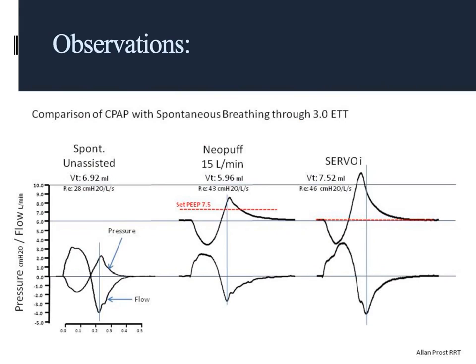All right. There are some differences in the expiratory flows, so the patient would possibly experience a little bit of air trapping if they had a high rate. How important that is, that's a difficult clinical question, but certainly the expiratory phase is slightly prolonged with the NeoPuff. So I think these are some pretty interesting observations with an intubated spontaneous breathing patient.